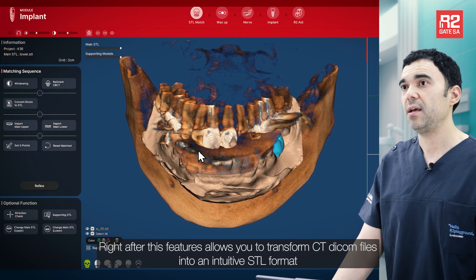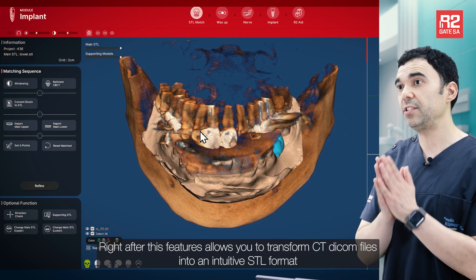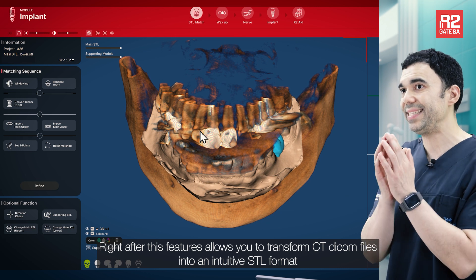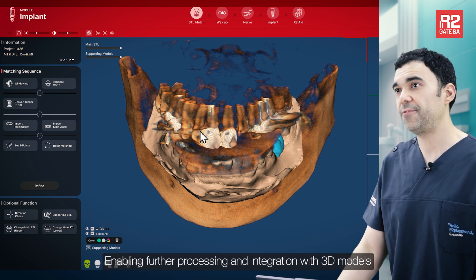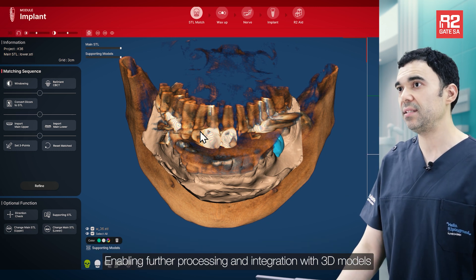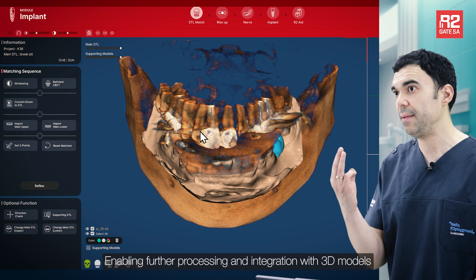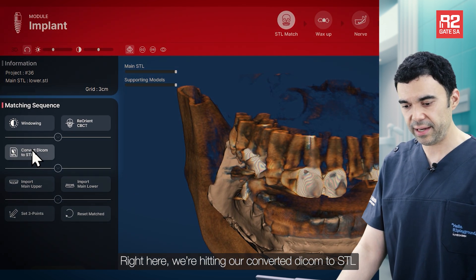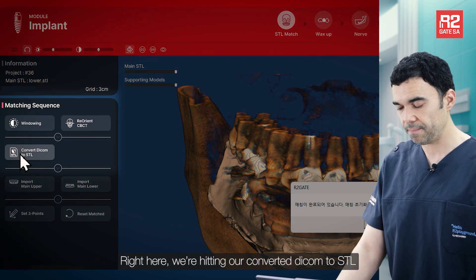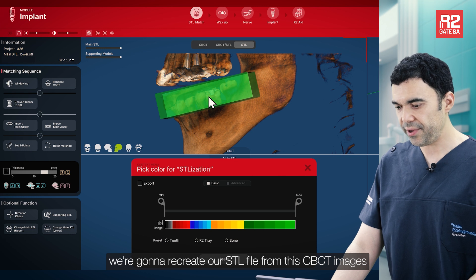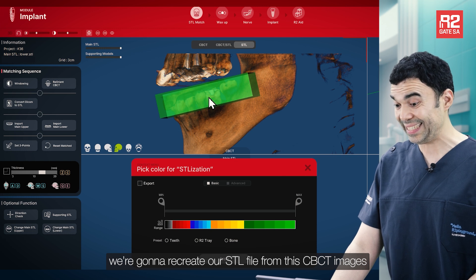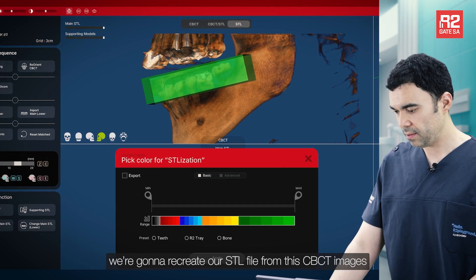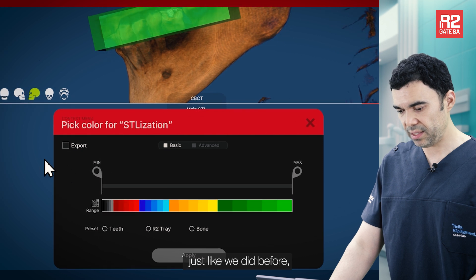This feature allows you to transform CT DICOM files into an intuitive STL format, enabling further processing and integration with 3D models. Right here, we are hitting our Convert DICOM to STL. We are going to recreate our STL file from this CBCT image, just like we did before.